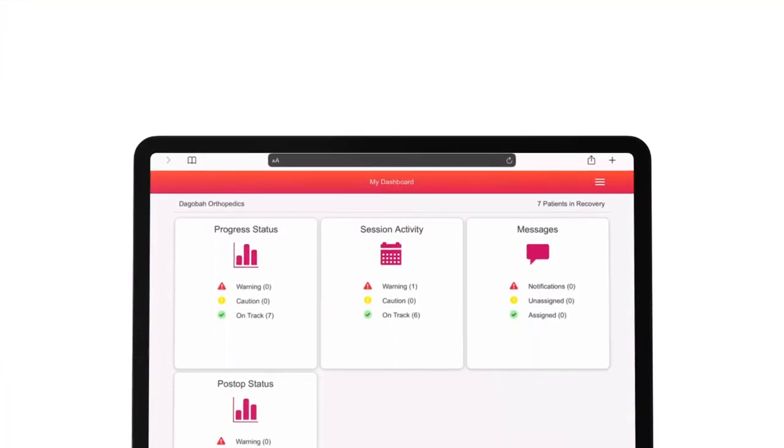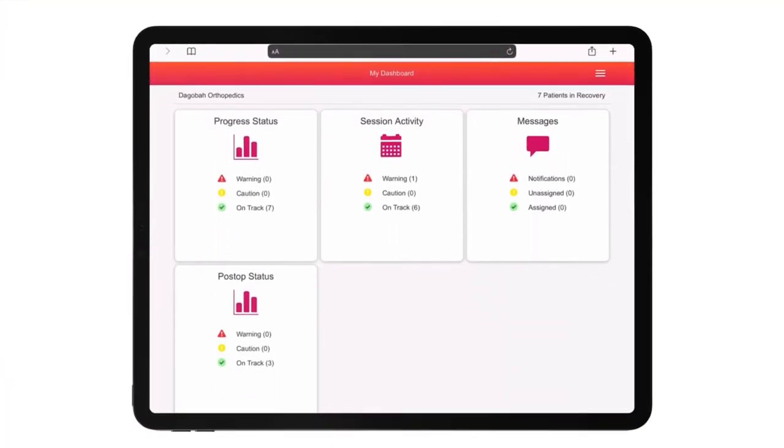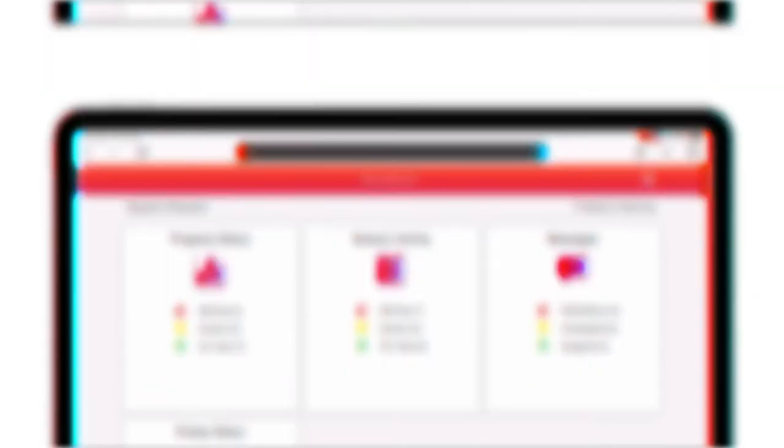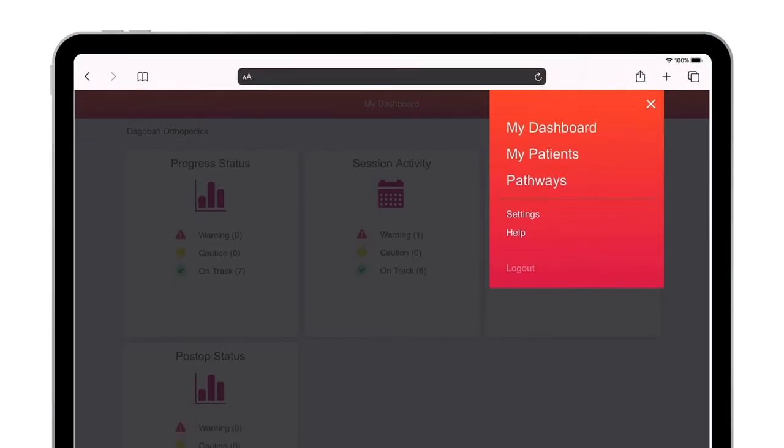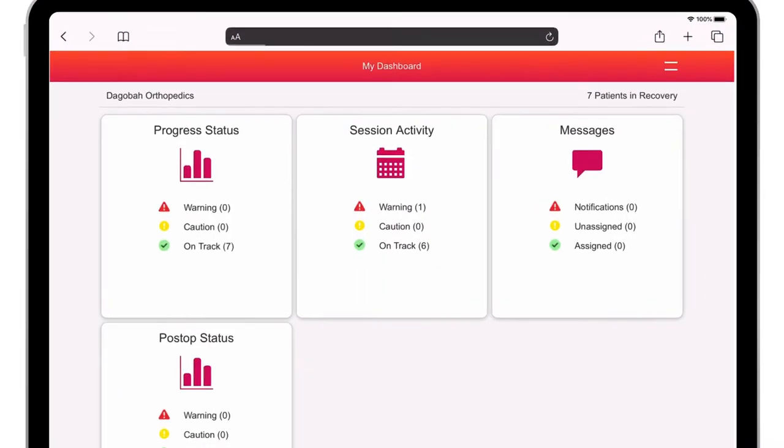Red, yellow, and green labels make it easy to see patient status so clinicians can know at a glance who needs attention.